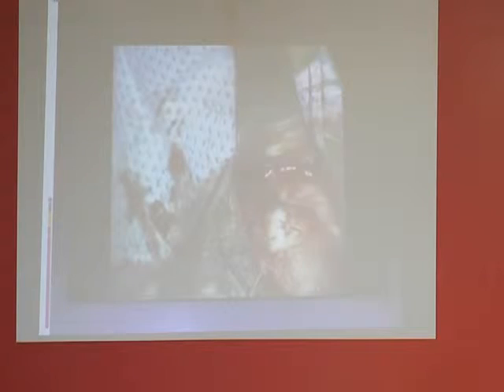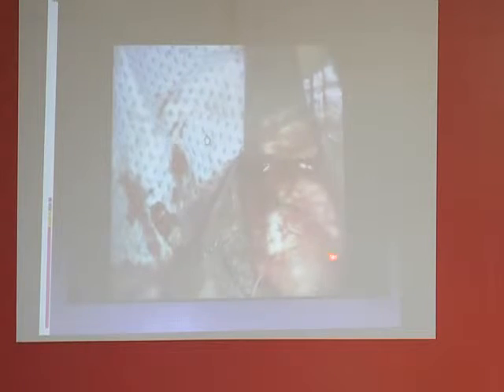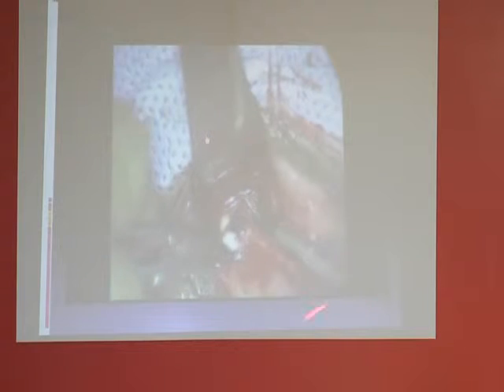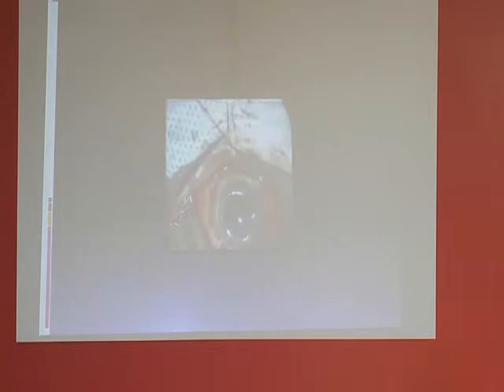So this is a patient who presented with a scleral tear, and the principles of trauma repair are basically well known. You first attempt to restore the integrity of the globe. Watertight suturing is important. In the same patient, you see there is severe hypotony. You can see the cornea is almost going inside.